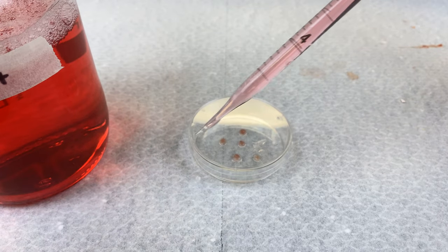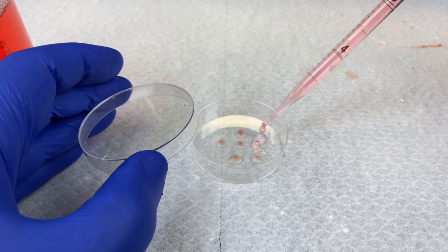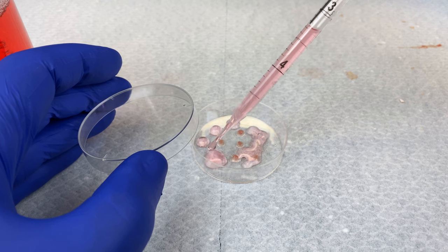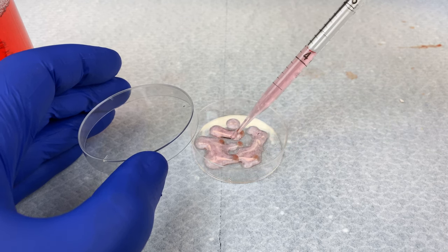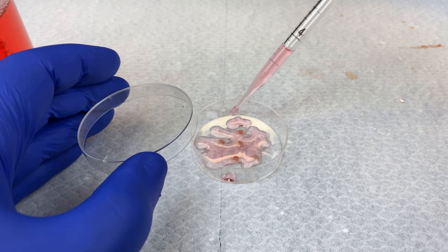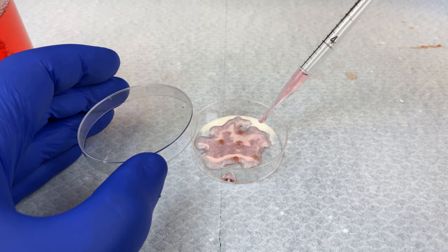Two and a half mils — you can see it will gently drip in. The purpose of the explant method is to put a small chunk of tissue on a dish. It will adhere, and then the cells on the outside will divide. They'll have no place to go but outwards, so it will appear as if the cells are migrating away from the explant.